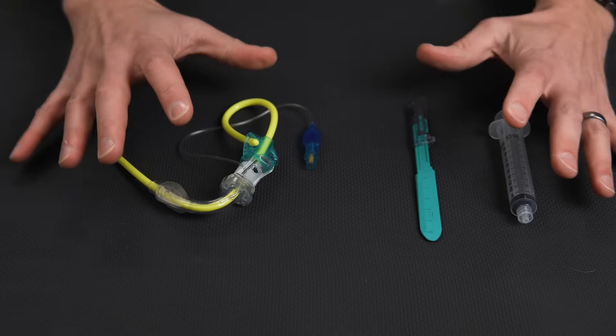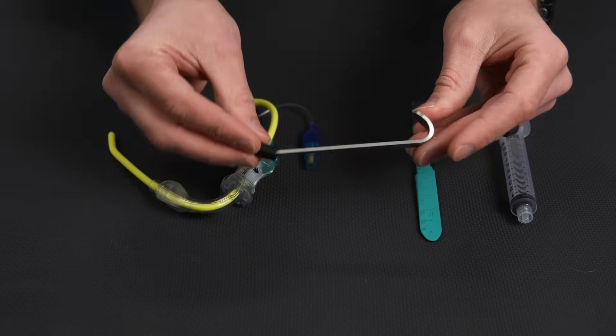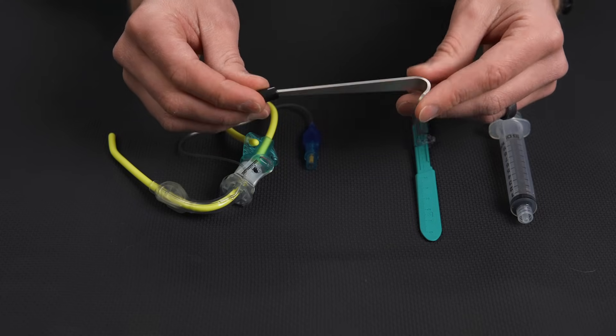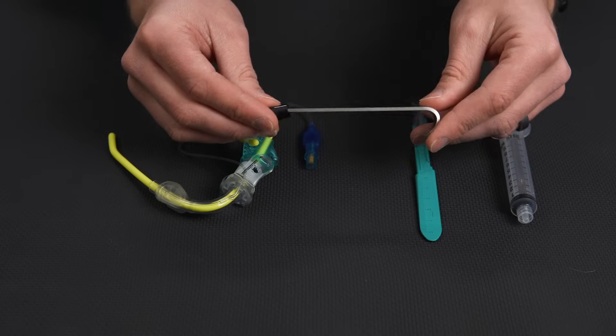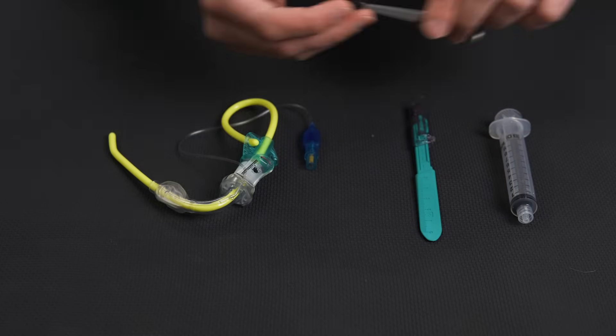There are a lot of different devices for doing this procedure. You can have a tracheal hook, which can be used to make this a little easier. I found that this kind of complicates the procedure and I don't generally use it, although we can talk about its use a little bit later on in this video.